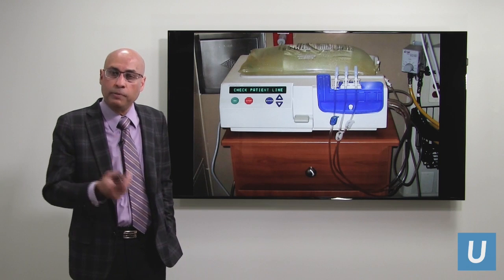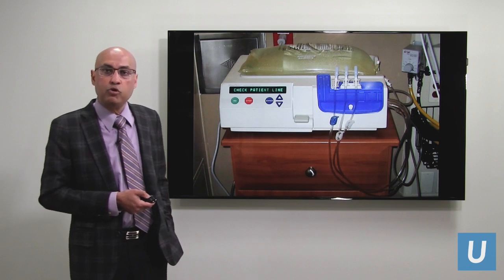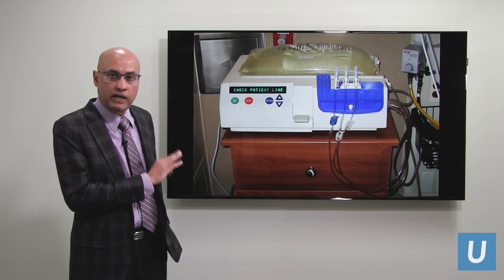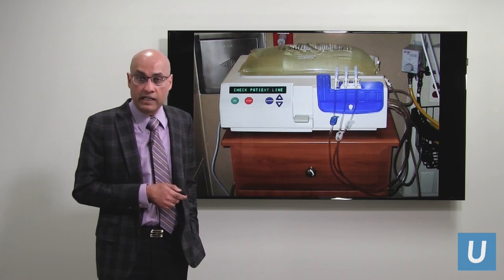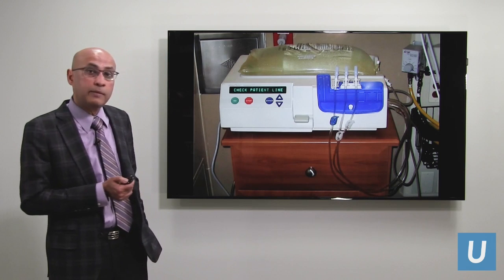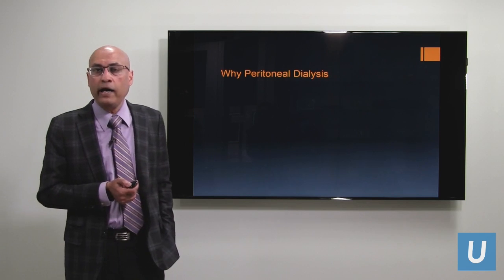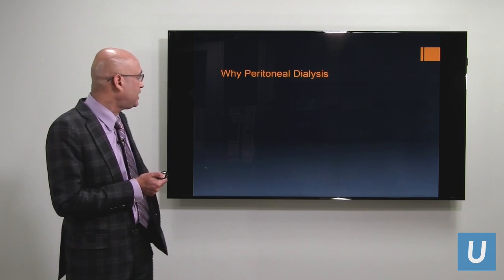And once again, we'll be discussing this a bit more in our future webinars, how you travel with the dialysis machine. But travel is one of the big advantages of being on PD. So it gives you much more liberty to travel. So why do PD? There are a lot of reasons.